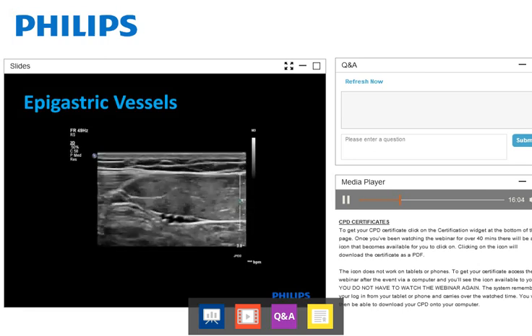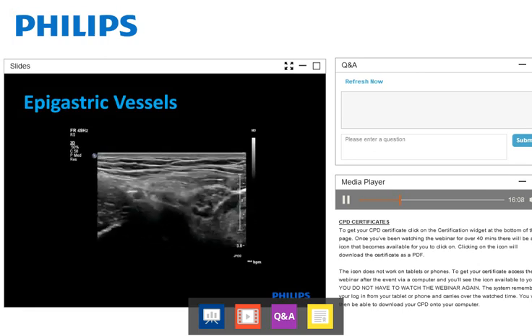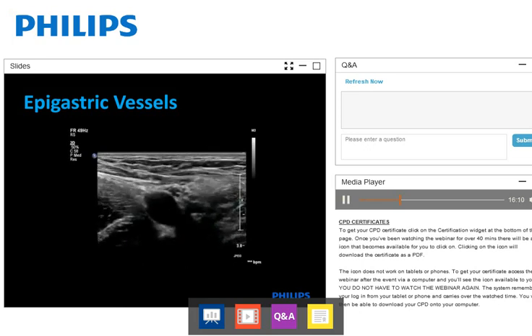As we'll see here on this scan, there we are in the middle of the rectus with those inferior epigastric arteries there, scanning all the way down, keep coming down until we see it originate from the external iliac artery, and just above that and laterally we can see the deep inguinal ring. So that's our really important landmark. We can see the deep inguinal ring there coming up in blue. There we are, and the origin of the arteries are coming up in red.